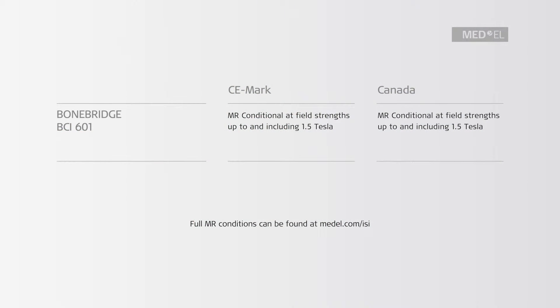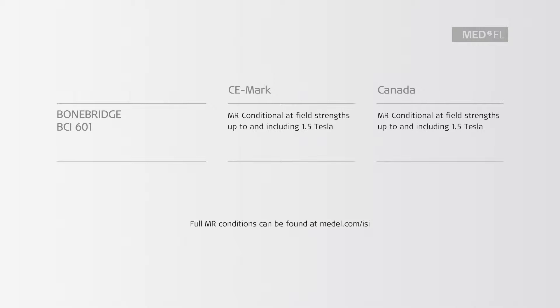Patients with the BoneBridge BCI-601 implant may be safely scanned without magnet removal at field strength up to 1.5 Tesla following the conditions described in the instructions for use. You can find the full safety information in the instructions for use shipped with each implant system, and you can always find an up-to-date version at medel.com/isi.